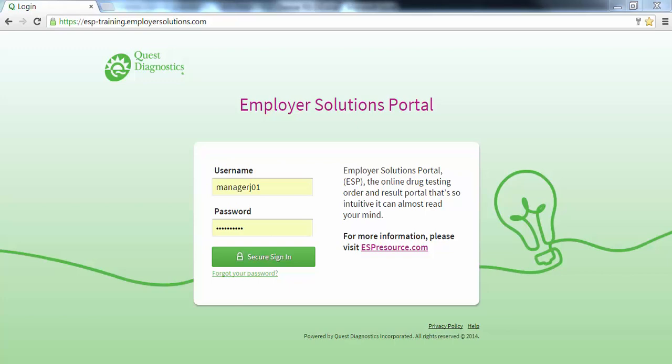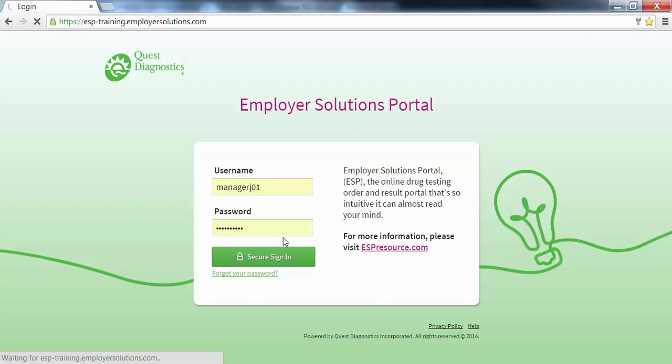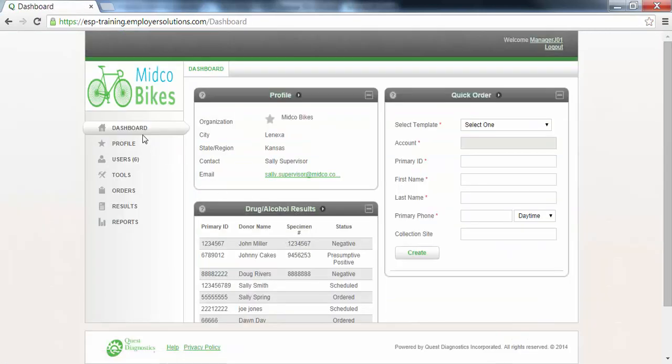We will begin by logging into ESP. At the login page enter your username and password and click the secure sign-in button. After successful login you will see the dashboard for your organization.